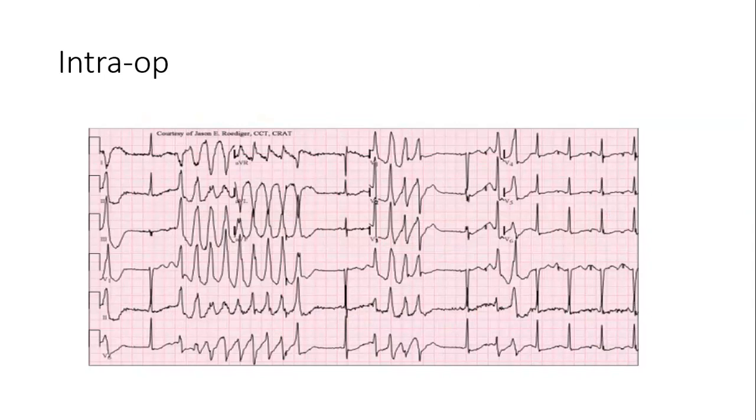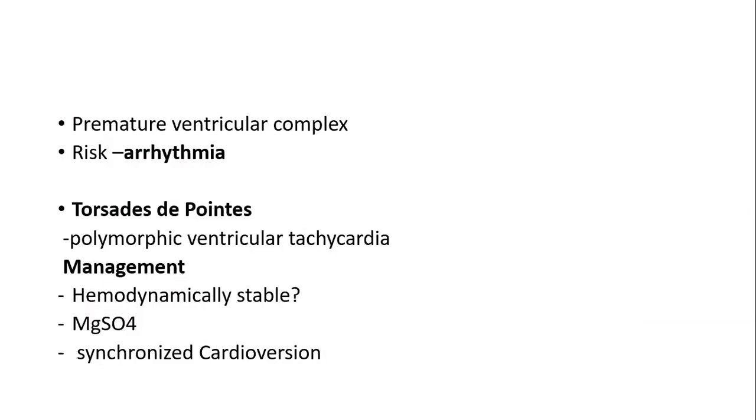But a lot of these sometimes, if these exams or examiners, particularly for a polymorphic one that has a specific treatment, they do want you to mention the name of it. Okay, I understand. Because it has a particular pattern compared to other ventricular tachycardia. Yes. But both answers will be correct.